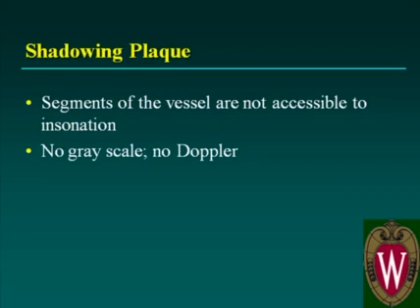One thing about hard plaque is that the shadowing will make segments of the vessel inaccessible to Doppler interrogation. If the sound waves are not reaching it to create a grayscale image, neither are they reaching it to create Doppler images. So no grayscale, no Doppler. If you are trying to insonate that segment of the carotid, frequently it is helpful to insonate the vessel from a different angle, or a different perspective.